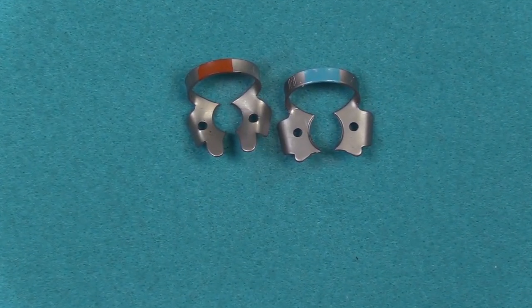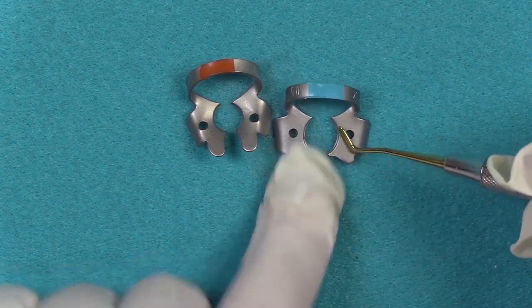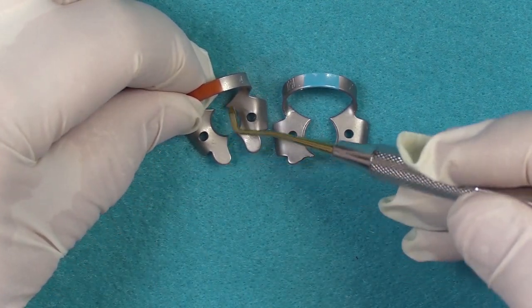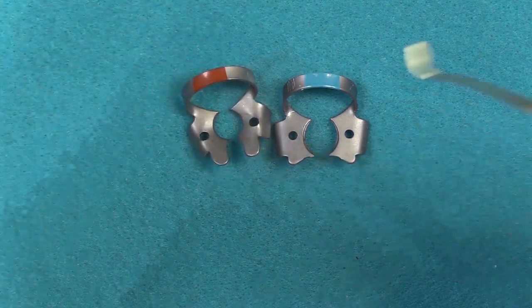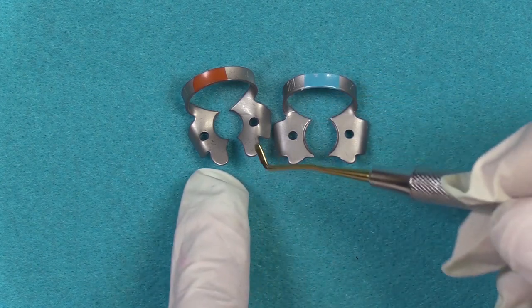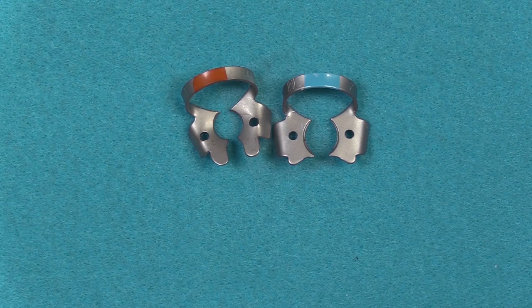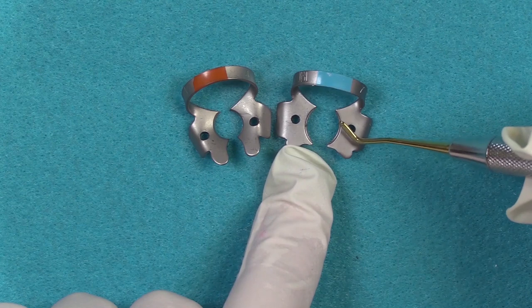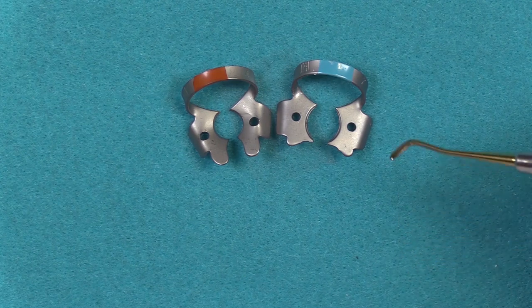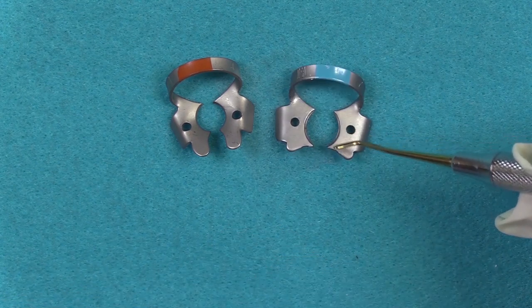When dealing with interproximal restorations, and particularly the last tooth in the arch, using the flat jawed clamp allows you to seat your matrix system. Notice how this number four clamp has more of a curve — the curvature in the clamp prevents the system from seating. If you did use a curved clamp, you would pretty much have to remove the clamp and then put your matrix system in place. The idea is to try to leave the clamp in place and seat the matrix at the same time, and the flat jaw clamp is more of a benefit for that purpose.